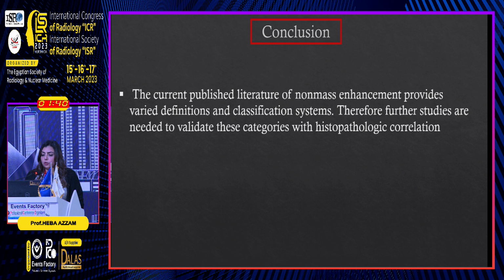The current published literature of non-mass enhancement provides varied definitions and classification systems. Therefore, further studies are needed to validate these categories with histopathological correlation.